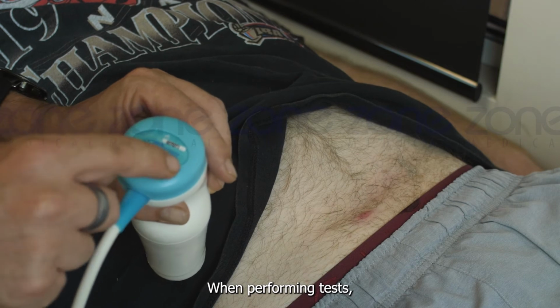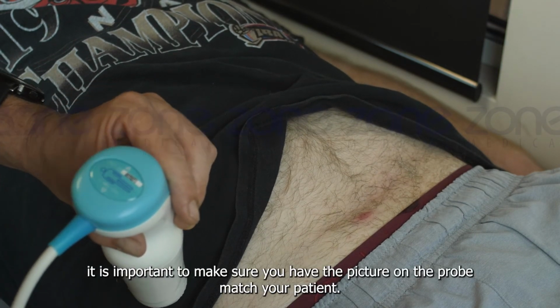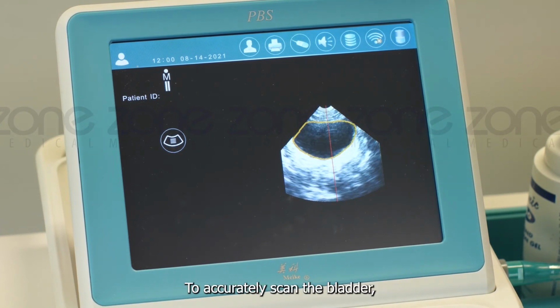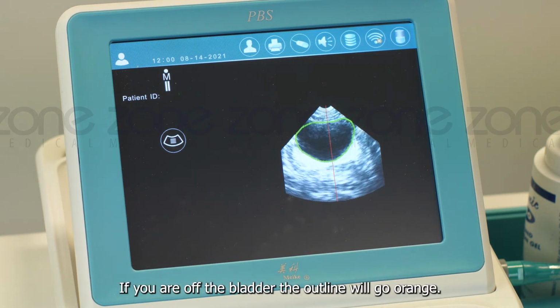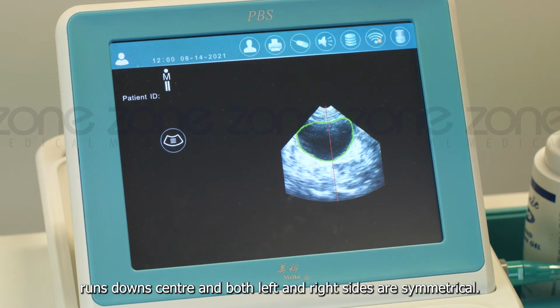When performing tests, it is important to make sure you have the picture on the probe match your patient. Start moving the probe to find the position of the bladder. To accurately scan the bladder, make sure that the outline is green. If you are off the bladder, the outline will go orange. Make sure that the red line runs down center and both left and right sides are symmetrical.